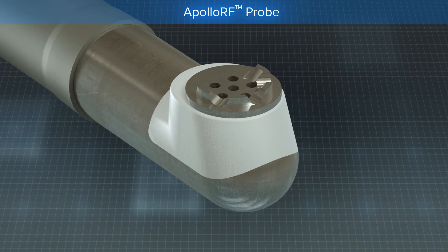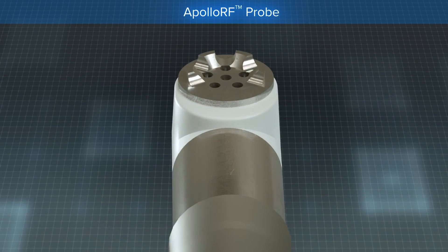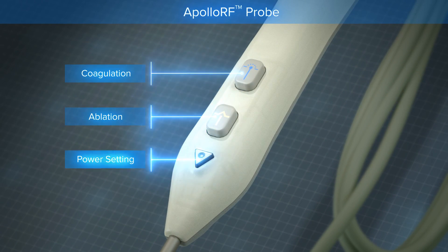The Synergy RF single-use probe has a specifically designed tip configuration that allows the surgeon to reach and remove tissue in a variety of arthroscopic procedures. The handle is ergonomically designed with easy-to-use buttons.